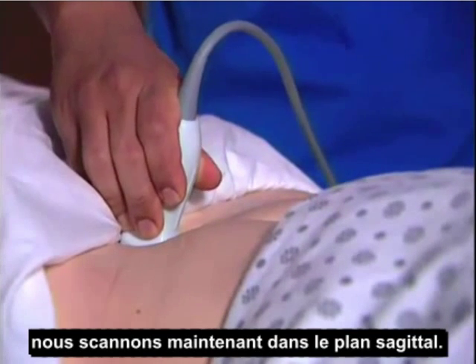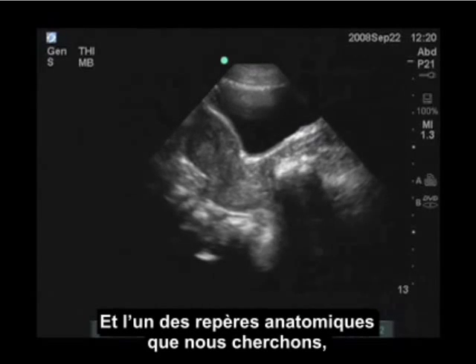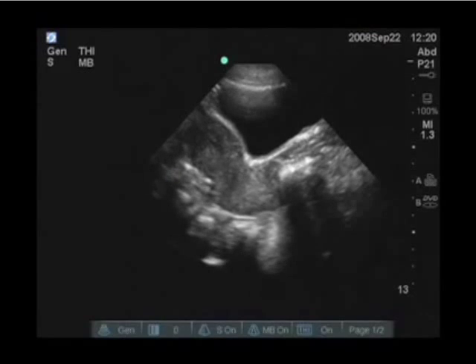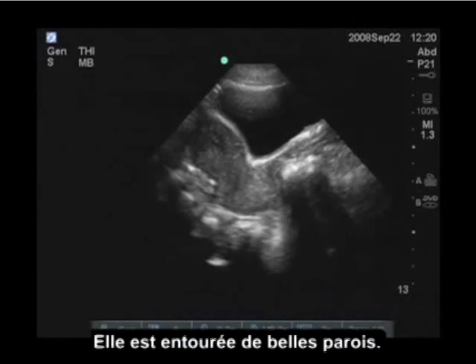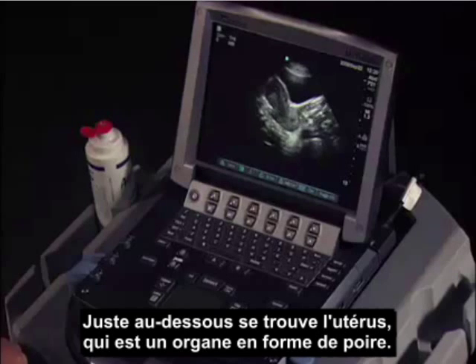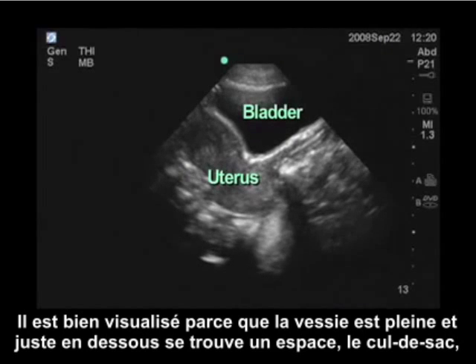So we're scanning now here sagittally, and some of the anatomic landmarks that we're looking at: at the very top of the screen is the bladder, which is an anechoic structure, fluid filled obviously with urine. It's got nice walls around it. Just below that is the uterus, which is a pear-shaped organ. You can see it well visualized because the bladder is full.